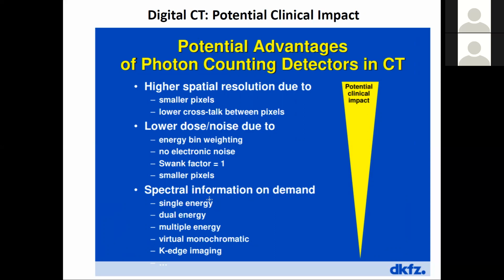So there has not yet been the type of killer app for dual energy that's made it to where, man, we better have the best dual energy you could ever have. And you don't have some of those other applications for the multiple. Those are all speculative, but we'll see. We'll see where this goes. But scientifically or mathematically, as it were, it'd be nice if the one that's actually principled was useful, but whatever.